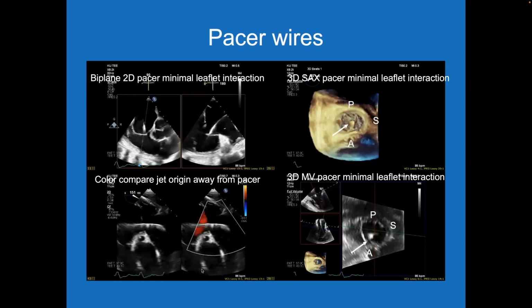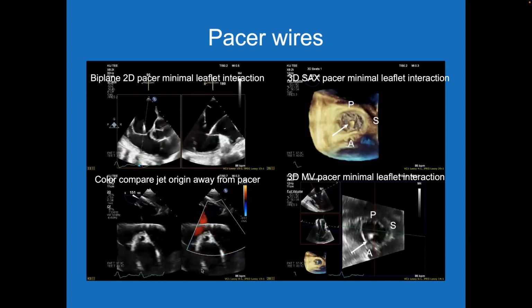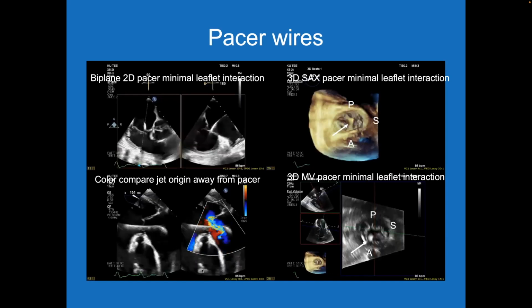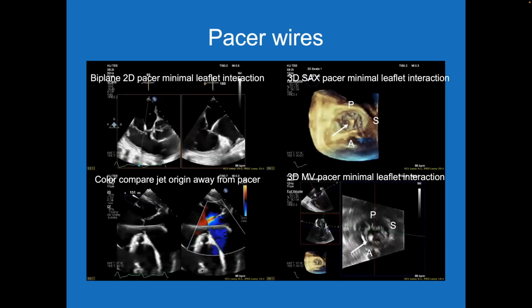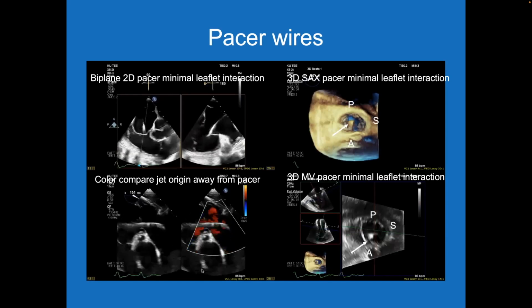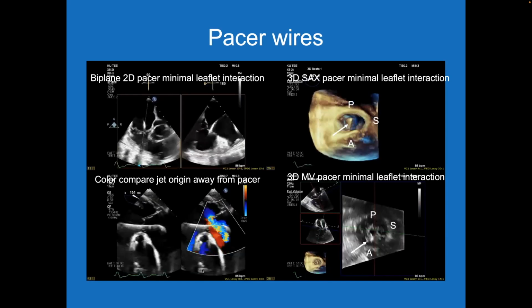And to take that further, on the right 3D reconstruction views, you can see the posterior, septal, and anterior leaflets, and you can see the lead from the white arrow is pretty centralized. And then a step further with a multiplanar reconstruction with all views on the bottom, you can see that it has some interaction with the leaflets, but it's mostly at the mid-coaptation point. So this is a patient that you potentially could clip, posterior-septal, anterior-septal, and improve the TR and just keep the pacer wire centralized.